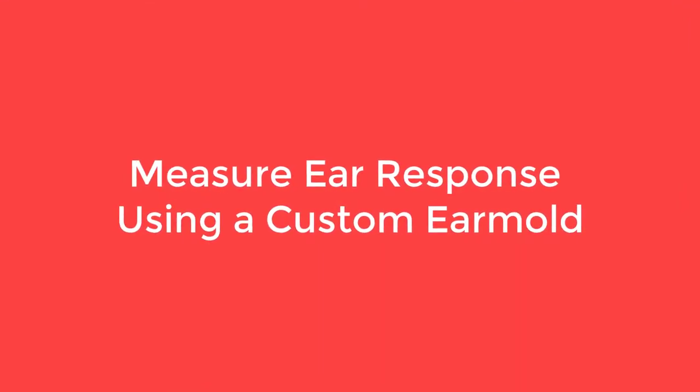If the patient has an ear mold, you can also measure the RECD ear response using his or her ear mold.